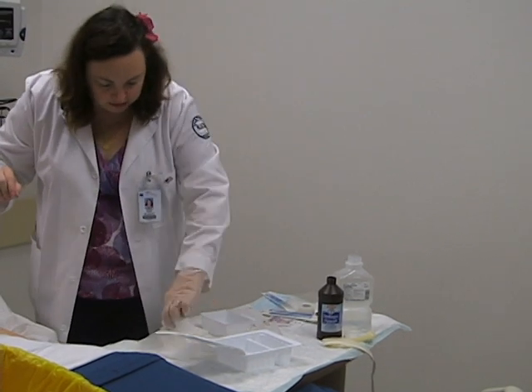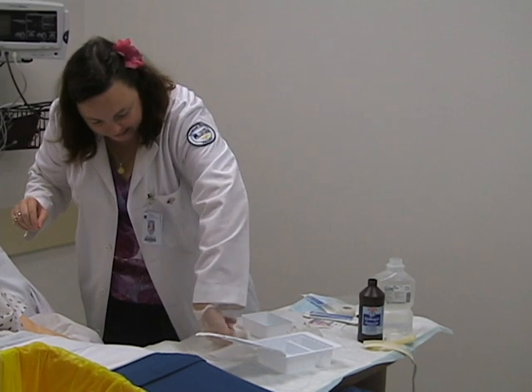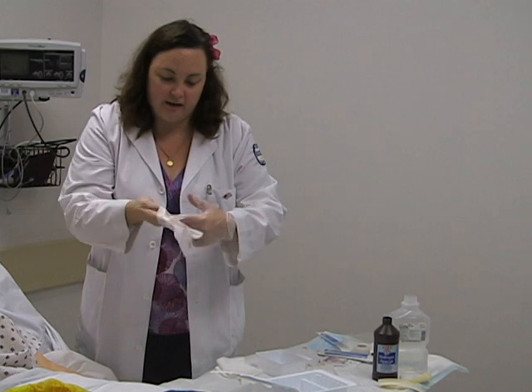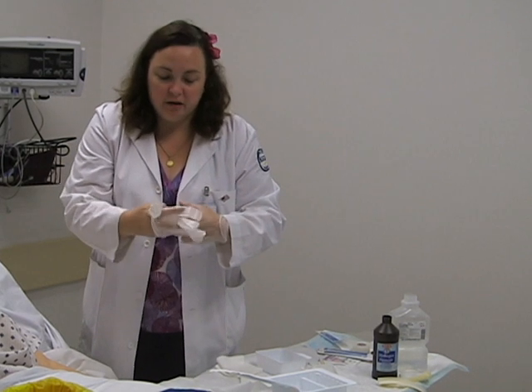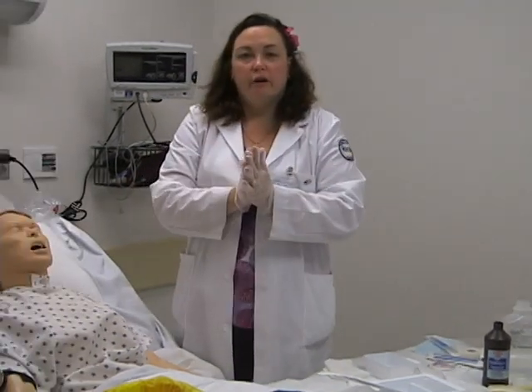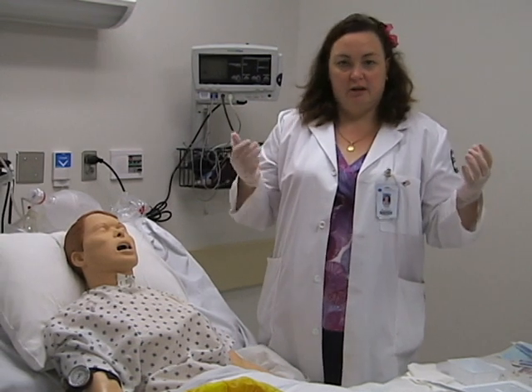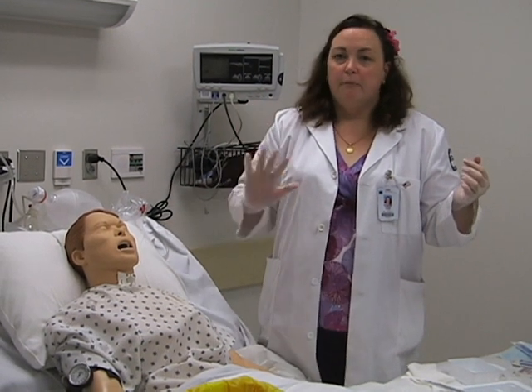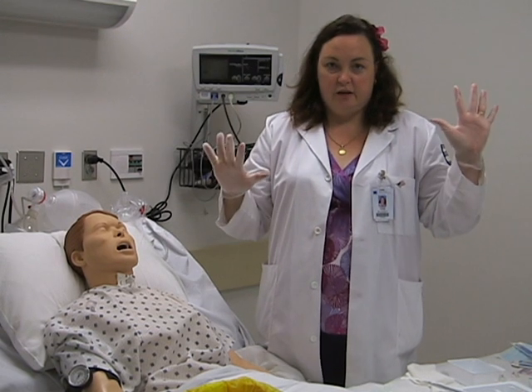I'll lift up my gloves — inside the cuff, like that — and put your hand in there. Please do not be alarmed if your fingers don't go into exactly the right hole; this takes practice. I really recommend that you all practice putting your sterile gloves on — the only way you're going to get comfortable with doing this is by repetition. Remember: this is your clean hand and this is your sterile hand.